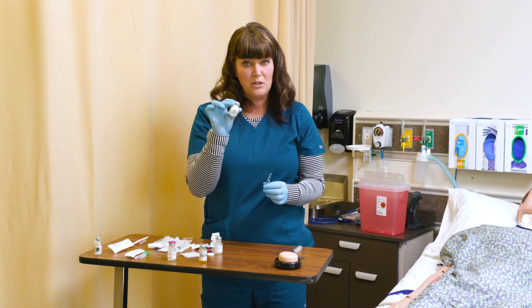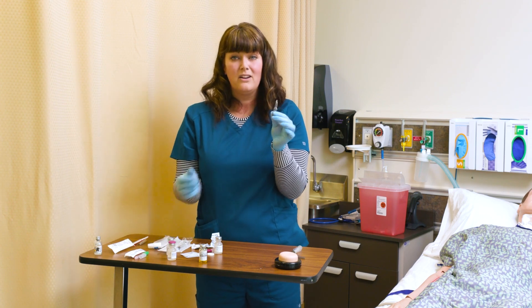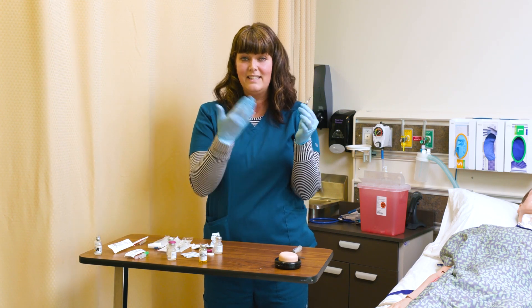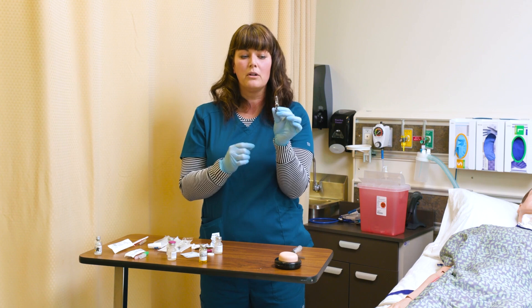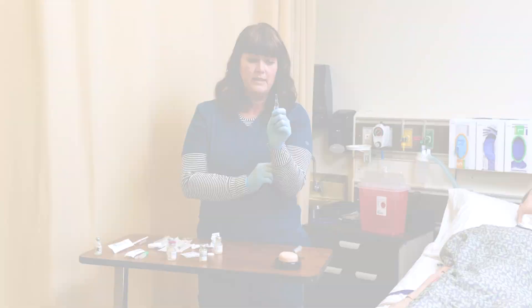Some medications are not stable in plastic. They need to be held in glass. They are also possibly not stable in light, so they are stored in amber glass — darker glass. This is what's known as an ampoule, and you're going to see these.